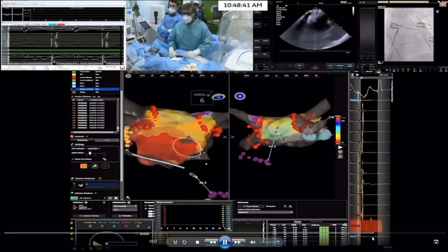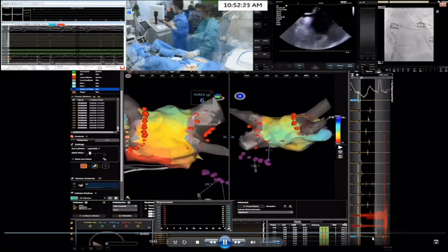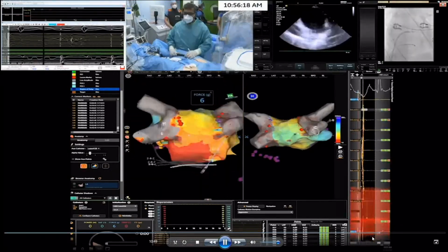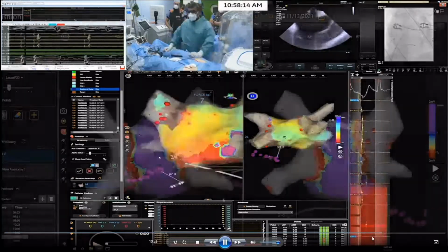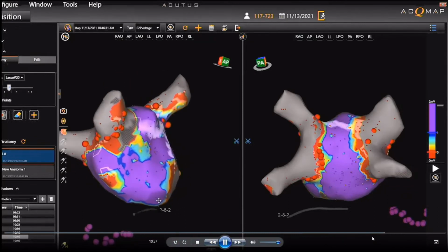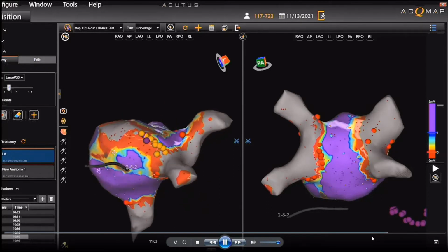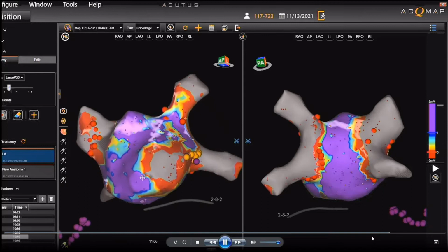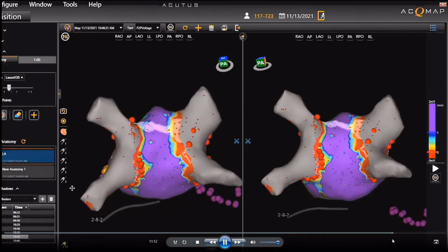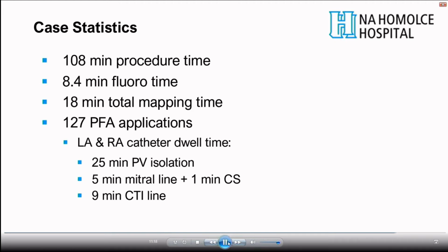Then he did the mapping of the left chamber to prove the electrical isolation level. It's done, and you can see that it changed from 9 something to 10:58, so about 11 a.m., and actually after less than 2 hours, he did this. Even the mitral isthmus line is visible. This is a bipolar map, not an activation map, and we have some information about the procedure itself. So I will pause here.